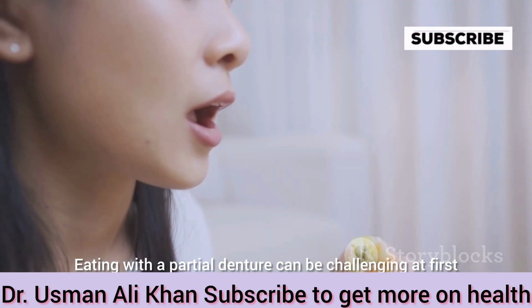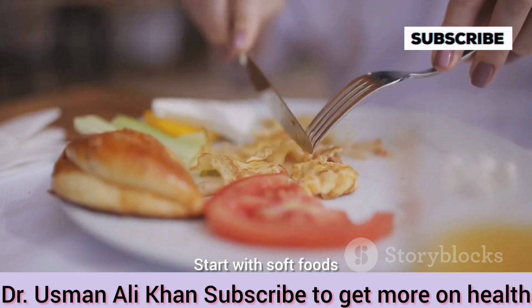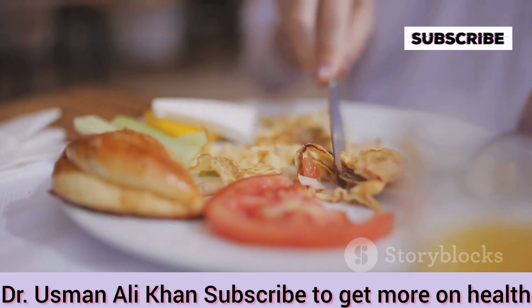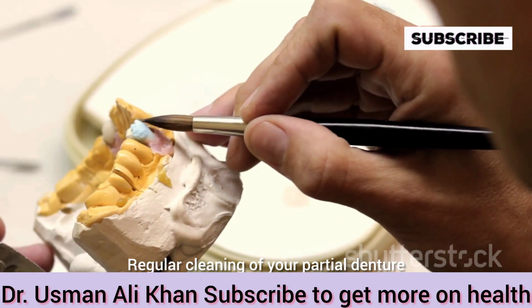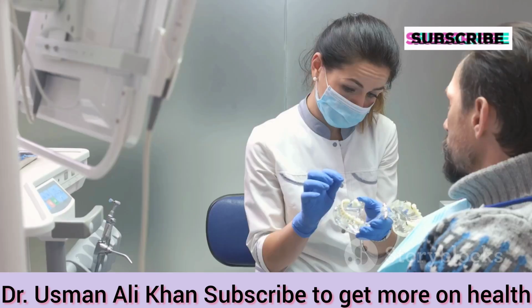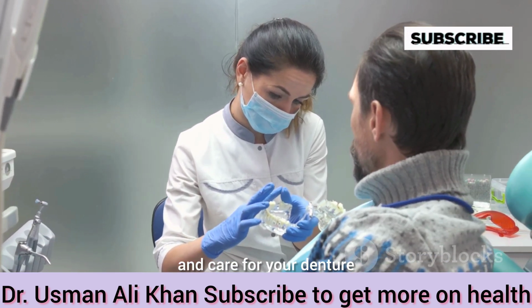Eating with a partial denture can be challenging at first. Start with soft foods and gradually introduce harder foods as you become more comfortable. Regular cleaning of your partial denture is essential to prevent plaque buildup and bad breath. Your dentist will provide instructions on how to properly clean and care for your denture.